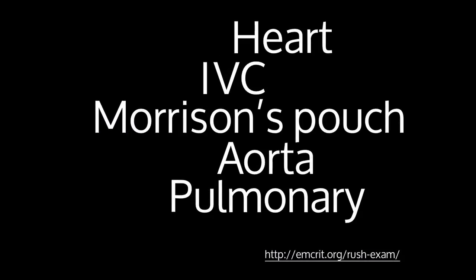There are two schools of thought regarding how to approach the patient with undifferentiated hypotension by using the RUSH exam. One is the pump-tank-pipes method, and the other way is the HIMAP method. I'm going to focus on the HIMAP method. What that stands for is heart, IVC, Morrison's pouch, which is a FAST exam, the aorta, and a pulmonary exam.